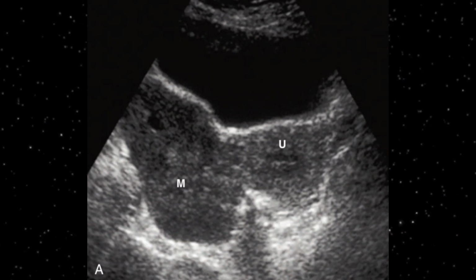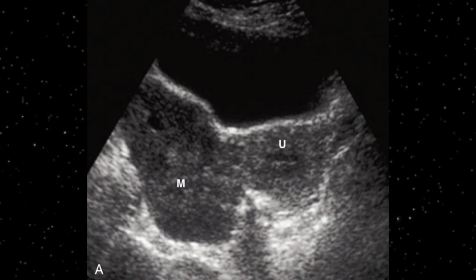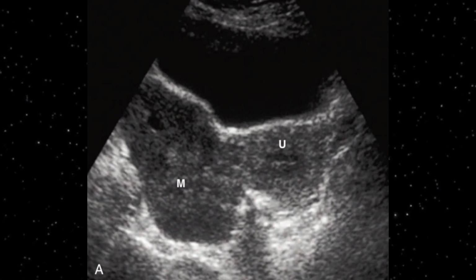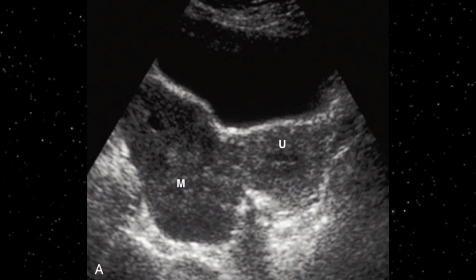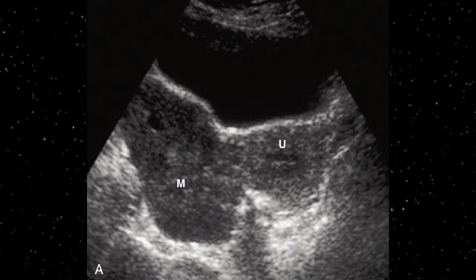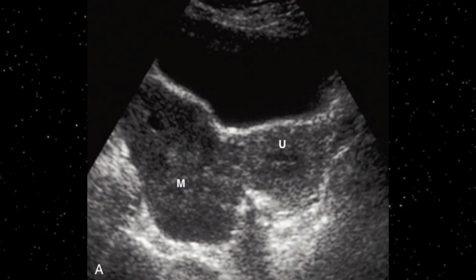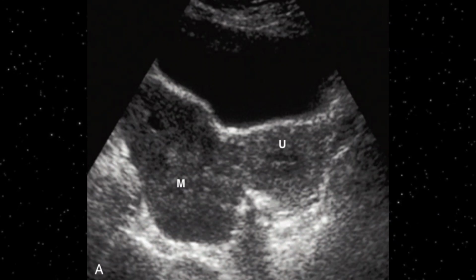It is adjacent to the uterus, so this appearance is quite confusing. Straight away the first conclusion would be a pedunculated fibroid, because it looks more like a fibroid, but actually this is not a fibroid. It has nothing to do with the uterus. This is in the adnexal area. In the right adnexal area, this large, predominantly hypoechoic mass is dysgerminoma.